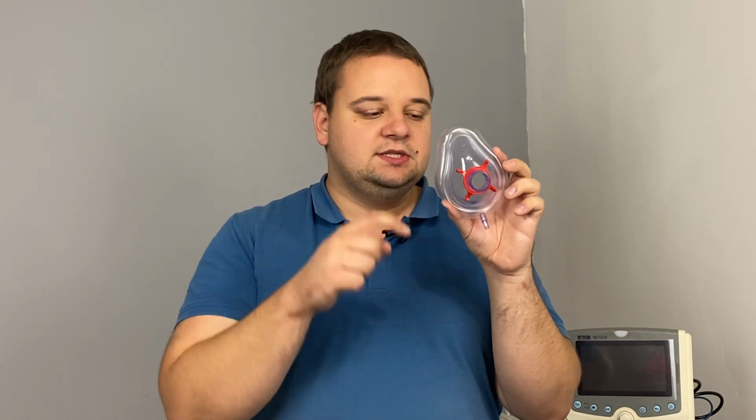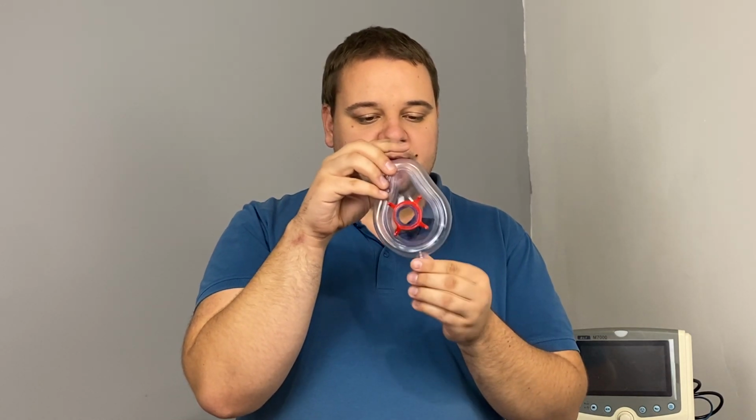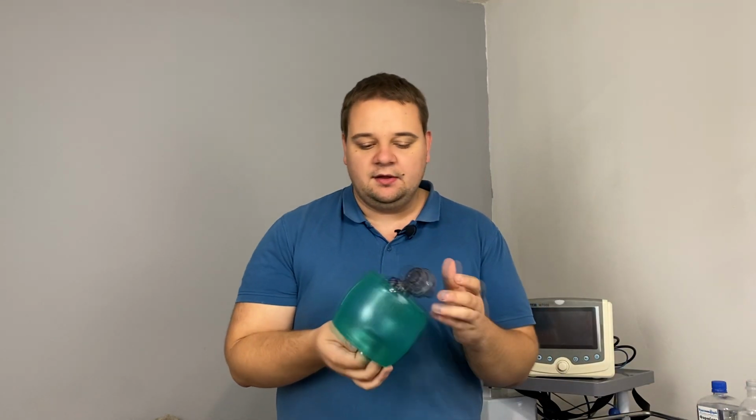The face masks are also of different sizes. Generally, this is one of the standard ones for adults. This upper part, the more shallow, is for the nose. The lower part is for the jaw. Here we connect the bag or the ventilation tubes, and that's the way that we apply that. I will show you on the patient more on how we hold that so that it will not leak any air. And there's also a ventilation bag.